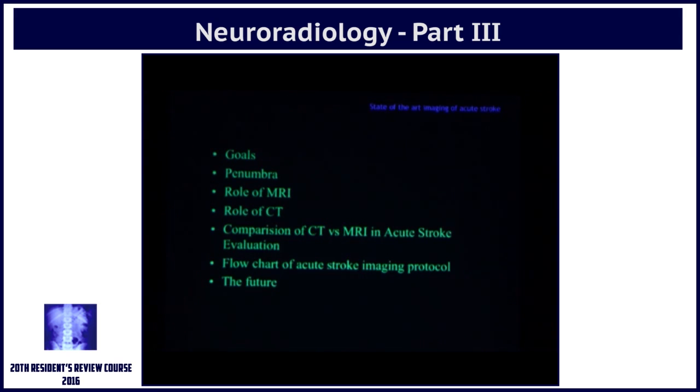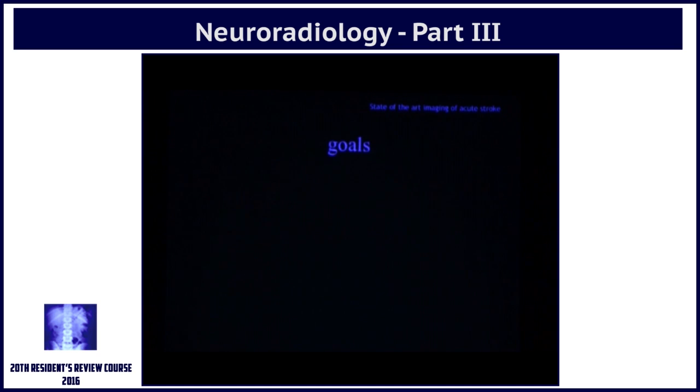We will discuss the key concept of penumbra, compare the role of CT and MRI, and look at a flow chart of the acute stroke imaging protocol.